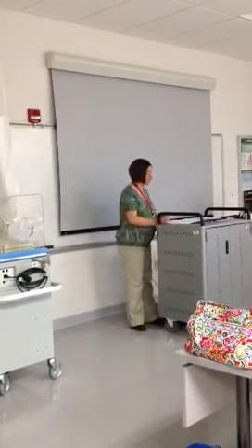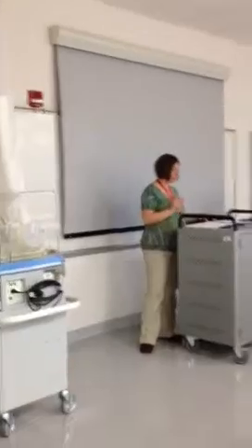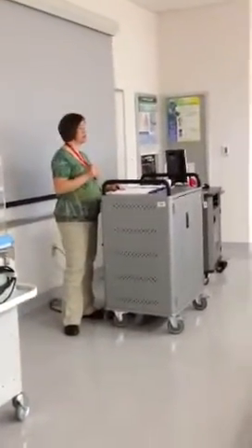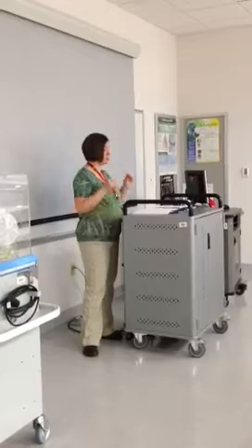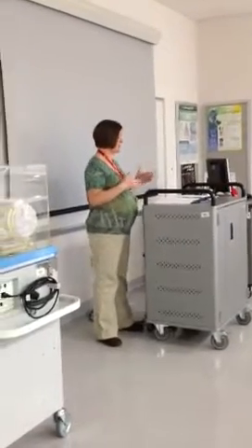So then we go on to the actual analysis, which is when you run it in the blood gas machine. It has basically the same indications, but the contraindications is what I want you to look at because it's a little bit different than the sampling part, because you've actually drawn the sample. So the first contraindication is that it hasn't been properly anticoagulated.